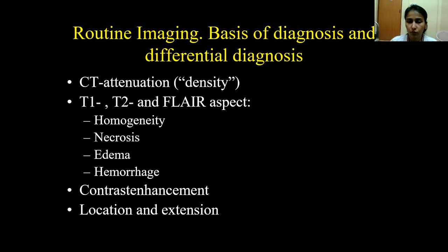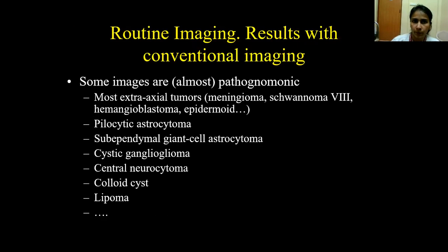And then after identifying the lesion, we have to mention the location of the tumor and the extension of the tumor, like what adjacent places it is extending to, and if there is any vital organ involved in it or not.